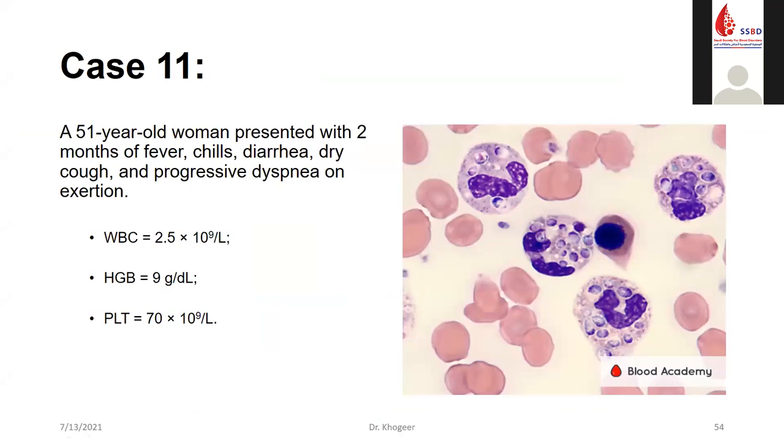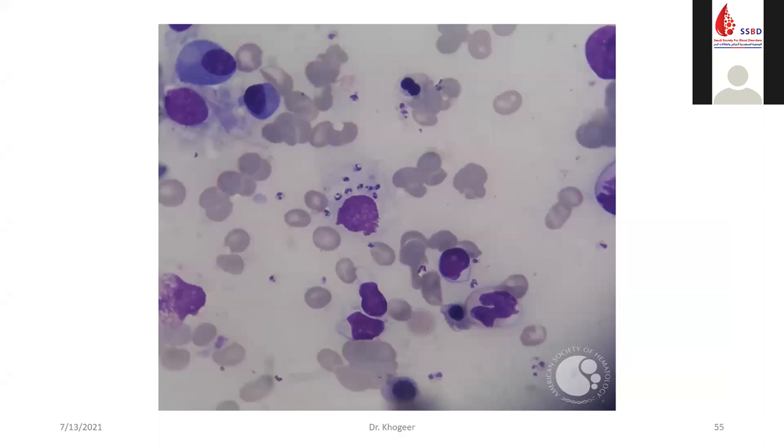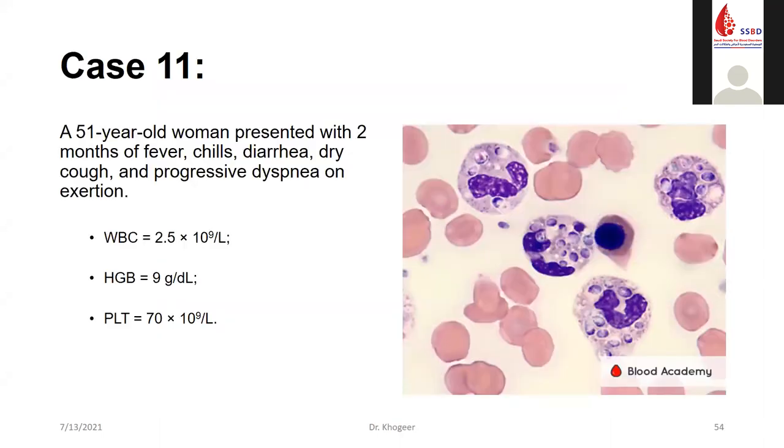So it can be easily differentiated from the small inclusions that are distributed extracellular and intracellular. And this is what we call a kinetoplast. And usually it's characterized by a double dot appearance, not like the histoplasma.